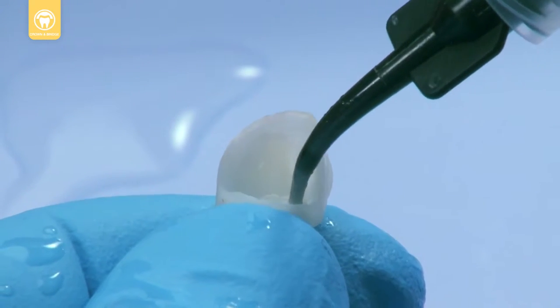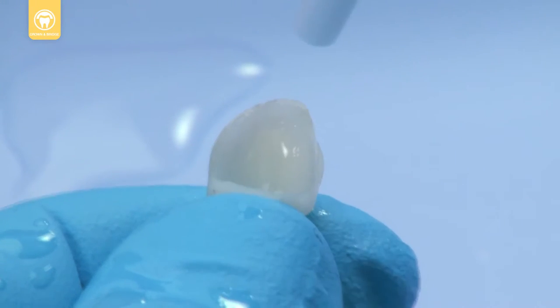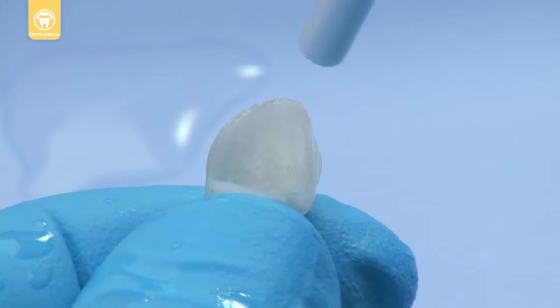Next, apply a puddle coat of silane to the inside surface of the prosthesis for 1 minute, air dry, and set aside. Do not rinse.